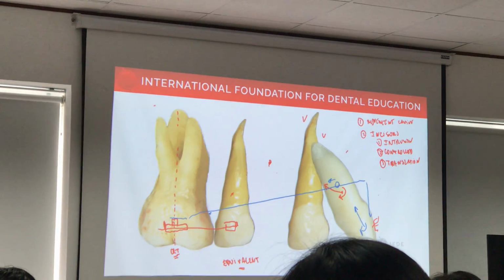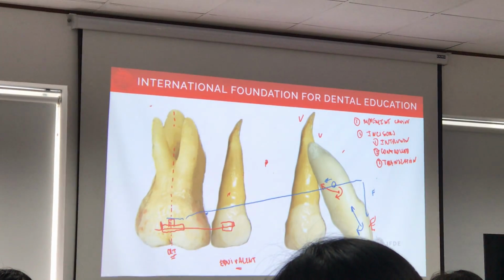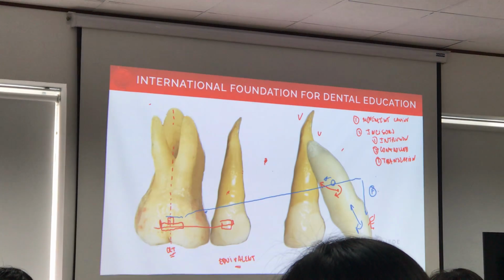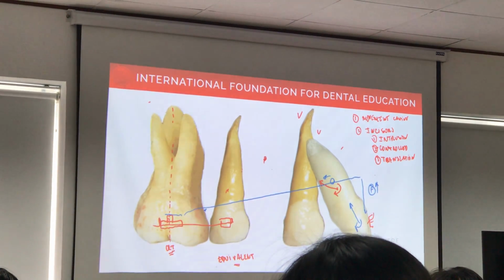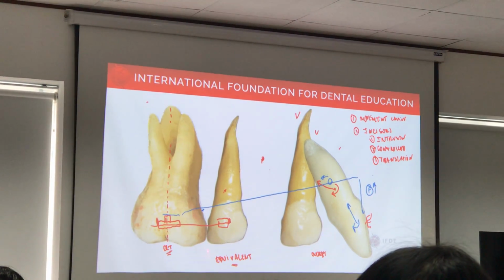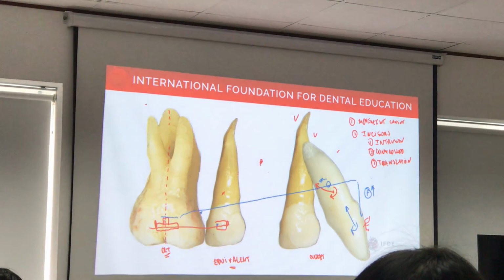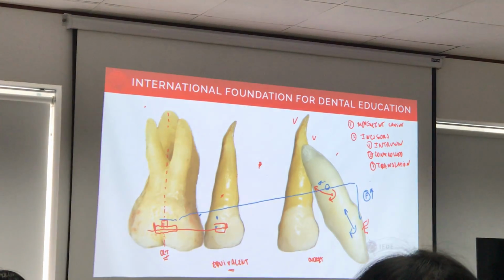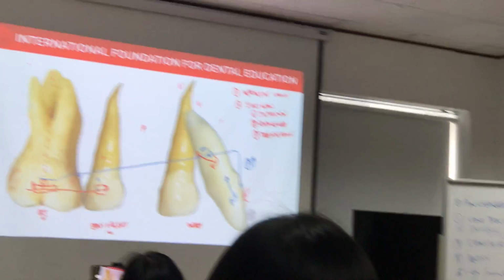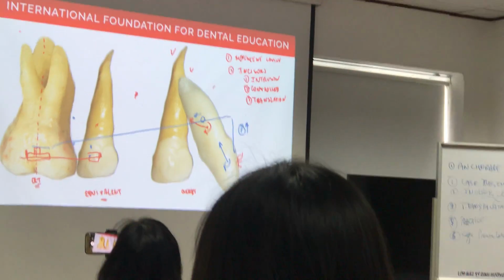So this force here that you've put, okay, that tends to extrude the teeth, is at a distance from here, right? Yeah. So here is the intrusive force, so this has to be what? The extrusive force, the force that makes the tooth erupt. This is right. So if you tie these two together, it's up to you. If you tie these two together, the center of resistance may be here a little bit.